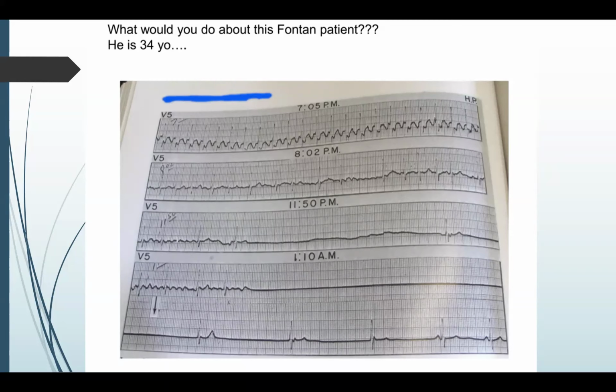And sometimes when you have consistent atrial pacing, it may suppress atrial tachycardias. Many Fontan patients, if they're atrially paced, will have at least a reduction in their amount of atrial arrhythmia, possibly even complete suppression. I follow 1 or 2 patients who are completely free of arrhythmia for 5 to 10 years at a time when they're paced. But when they're not, they're in junctional rhythm and they do have IART with some regularity. So in this case, with this type of pausing and this type of arrhythmia, I would say the first step would probably be to put a pacemaker in this patient and bite the bullet.